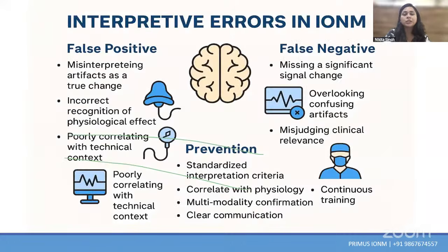These are the false positive and false negative responses. Due to misinterpretation of the responses, we tend to get false positive and false negative results.